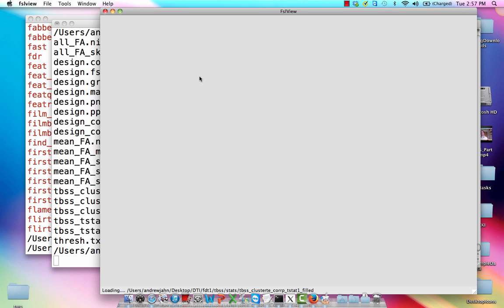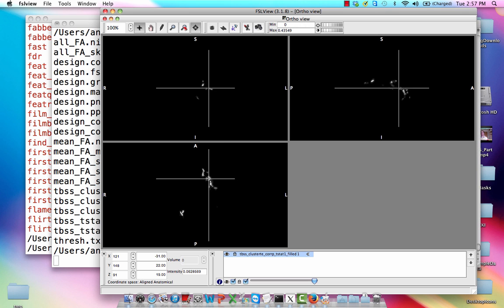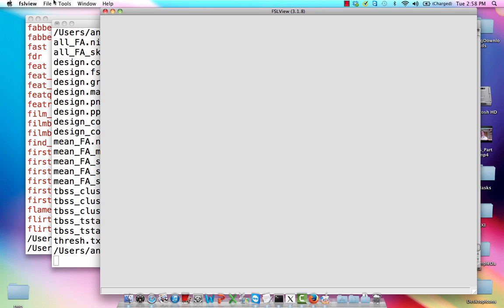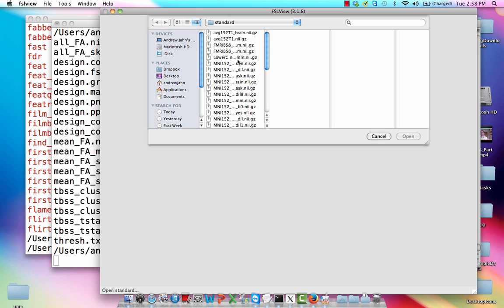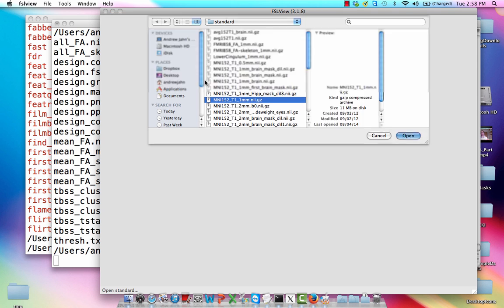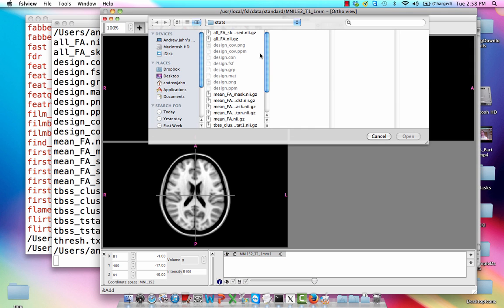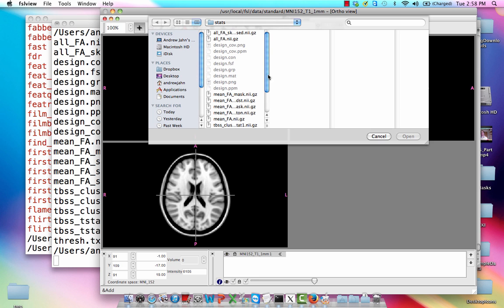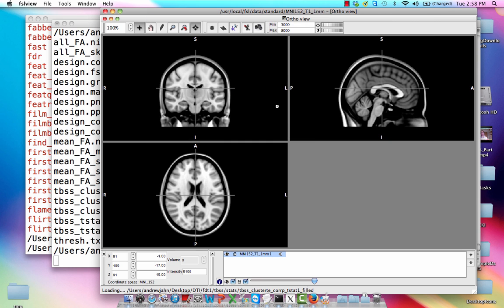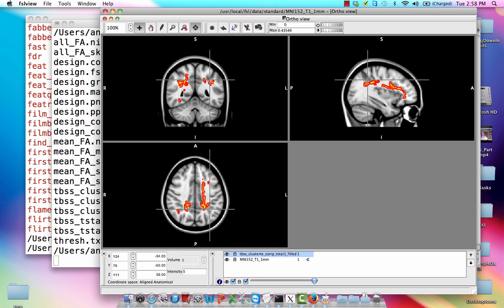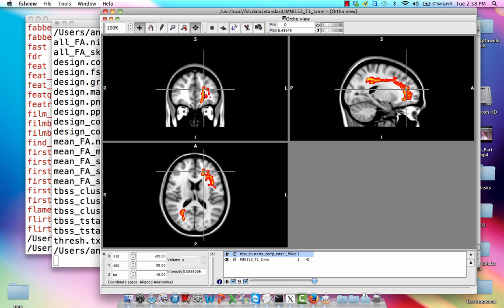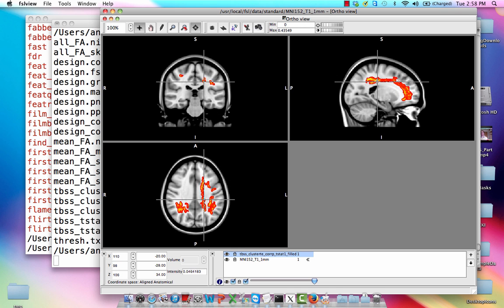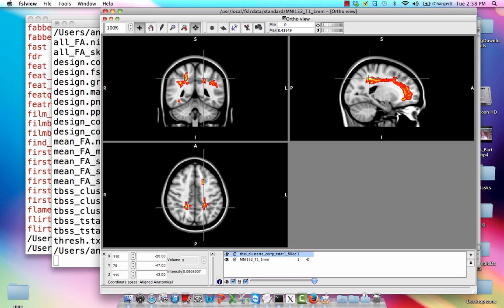We could project this onto a standardized space to make the - actually let's do that. Let's open a standard. Let's open MNI. And then on top of that, we can add that filled image that we just made. It'll just take a second. And it's already been color coded, which is nice. So basically what we're seeing here is any places in a contrast of young minus old. So we're seeing differences in white matter tractography between those two populations or those two groups. Great.